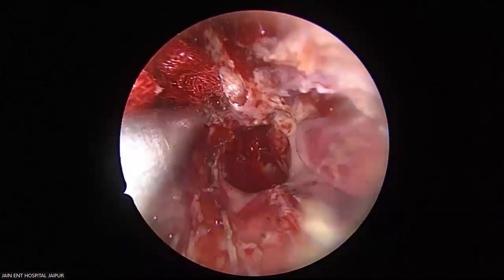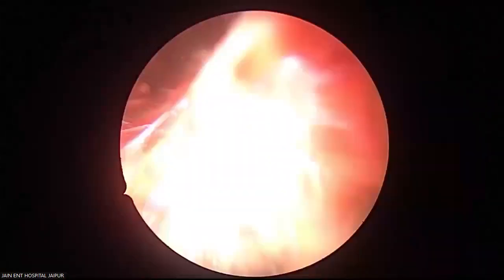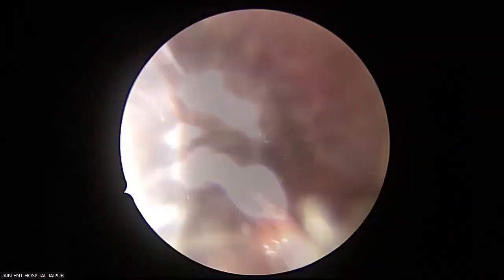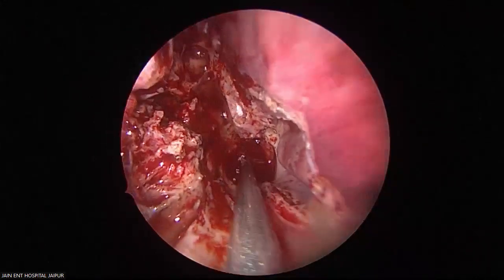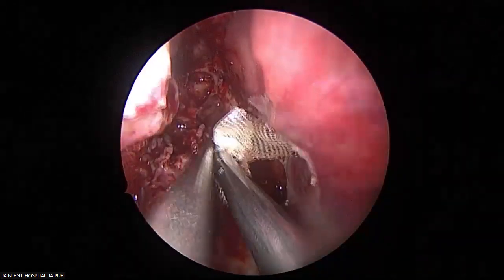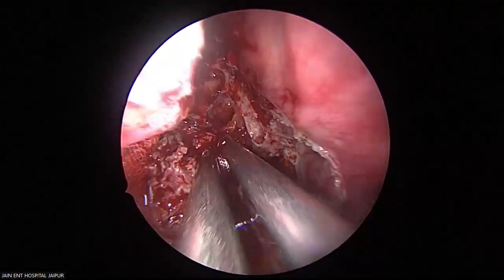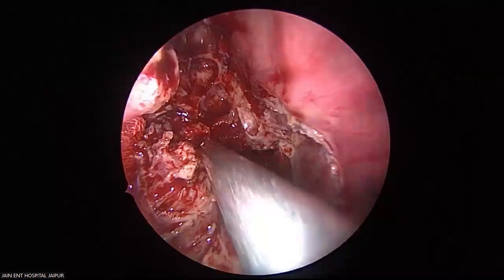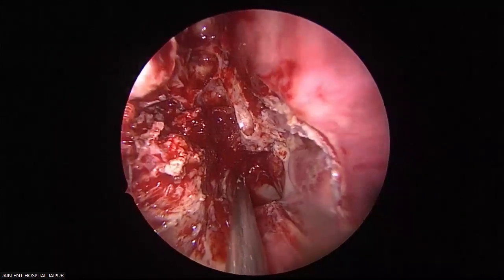Now give me a piece of Surgicel. See, this tumor which we have cut here is obviously going to bleed a little bit. Yeah. See this? This one. Now this surface I will press for a while.